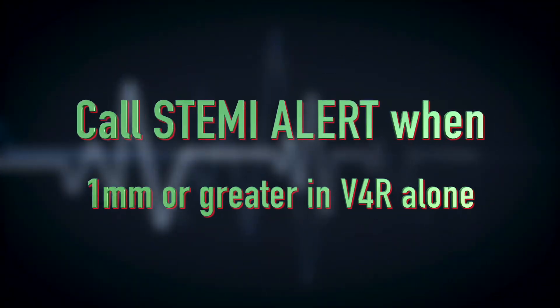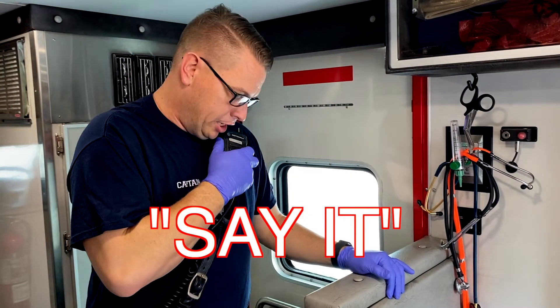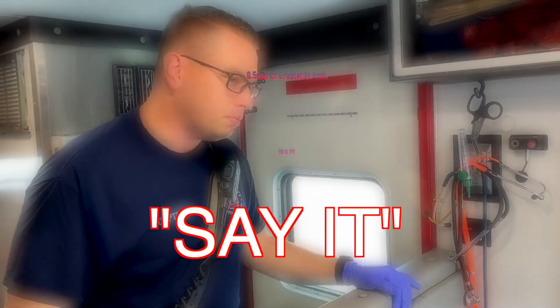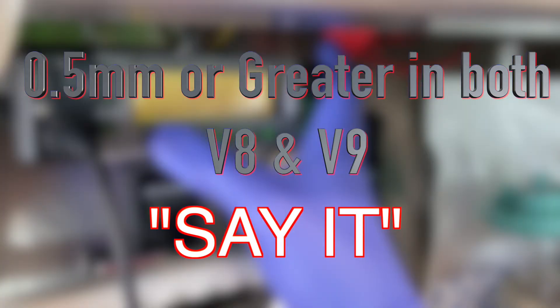Now that we have our 15-lead EKG in hand, here's the STEMI criteria. If you see one millimeter of elevation in V4R alone, call a STEMI alert. If V8 and V9 both show even a half a box of elevation, you can confidently call a STEMI alert. Remember to let dispatch know and also let the receiving hospital know you are bringing them a STEMI alert. This is the 'say it' part.